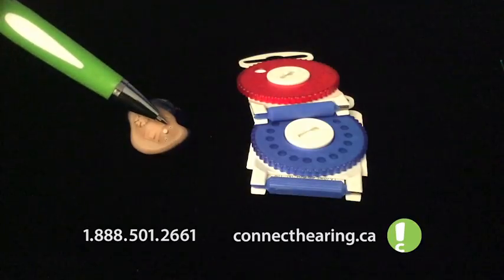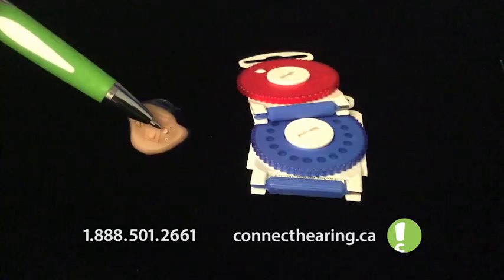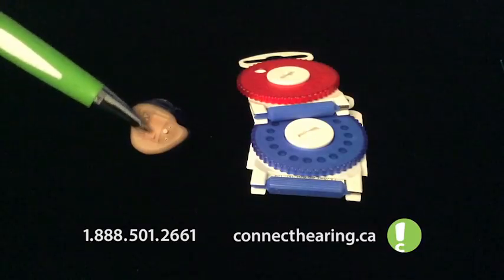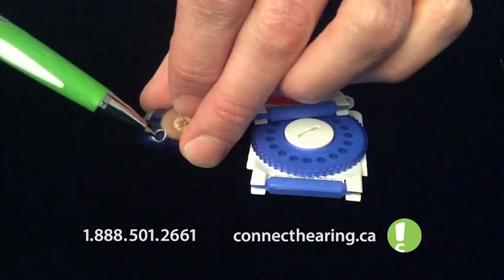On this hearing aid, we've got our front microphone, our back microphone, we have a push button for selecting different programs, our battery compartment, and our volume control wheel here. Over on this side, we have the air vent.